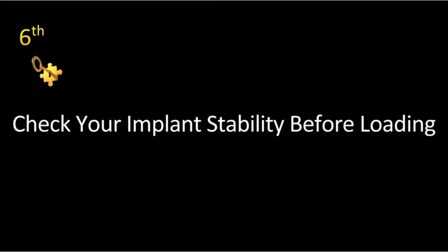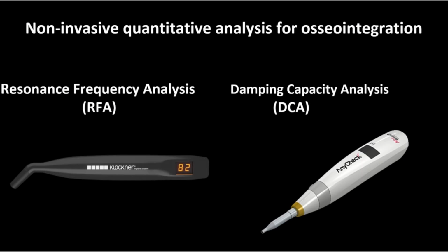Let's start with key number 6, which is discussing how we can calculate the stability of the implant. If implant procedure is among your daily workflow, you should test your implant stability before the prosthetic phase. You should keep in mind that the power of healing is completely different between patients. Also, if you are seeking immediate loading, you should have an adequate amount of stability.